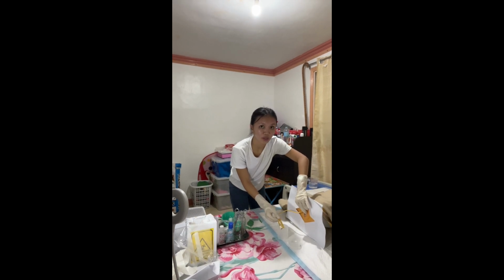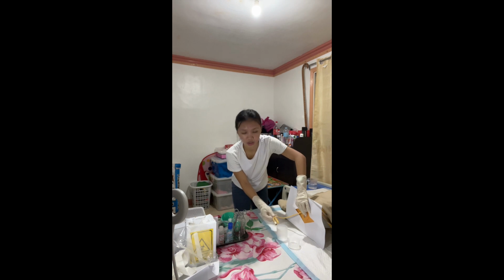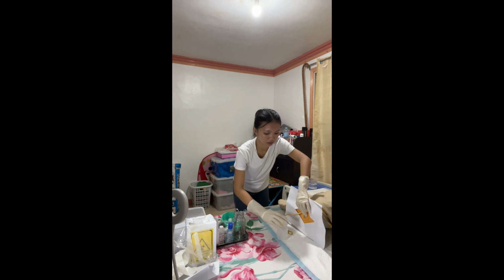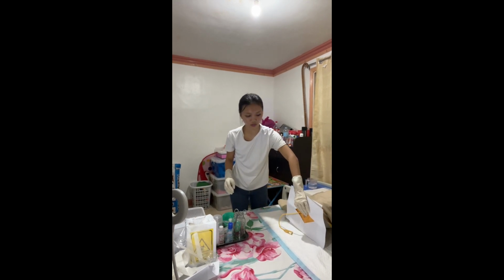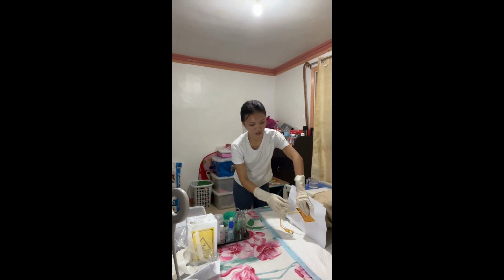Next, we are going to rest the hand on the pubis area while holding the catheter in place to prevent pulling and pushing of the catheter. Withdrawing the catheter and pushing it back in the urethra increases the possibility of contamination of the urethra. Okay, so now we can put this back and then relax our thumb and fingers so that we do not push and pull the catheter outside the urethral meatus. Next, we are going to connect the catheter to the urine bag.